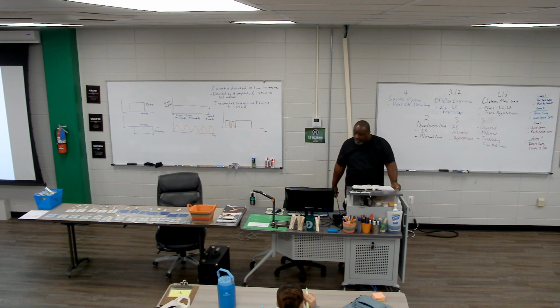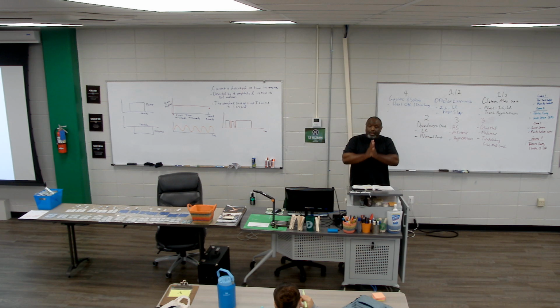That's kind of where I wanted to get you to. Okay, so those are the different types of waveforms, or current types. Again, not all machines will have DC, not all machines will have AC, not all machines will have pulse currents, or they have variations of it.